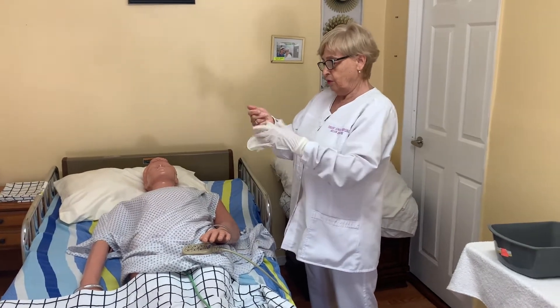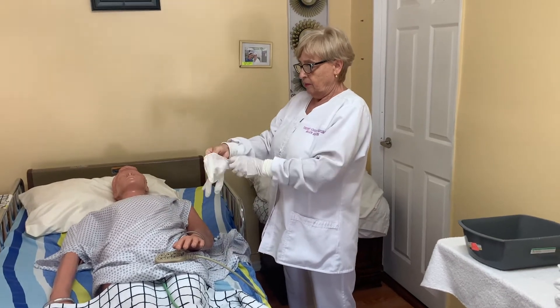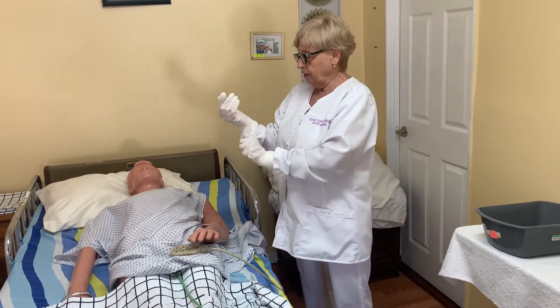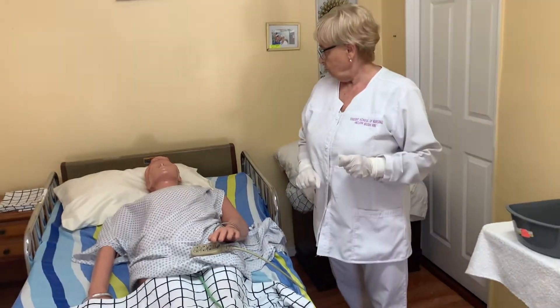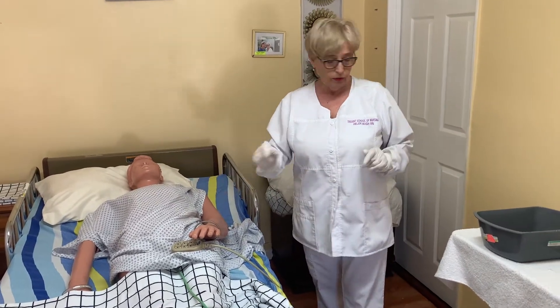This procedure requires gloves because you are touching body secretions. How often do we clean the catheter? We clean it one time with the complete bed bath in the morning, and any time when you change the diaper and it is soiled — where they have stool — you have to clean it.